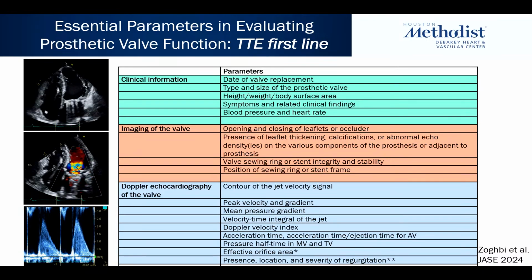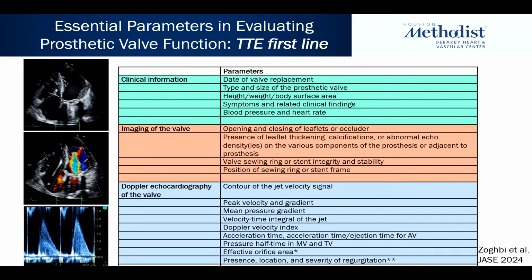Imaging of the valve, I know we're more limited in transthoracic echocardiography as to the opening and closing of the valve leaflets in mechanical valves and otherwise.